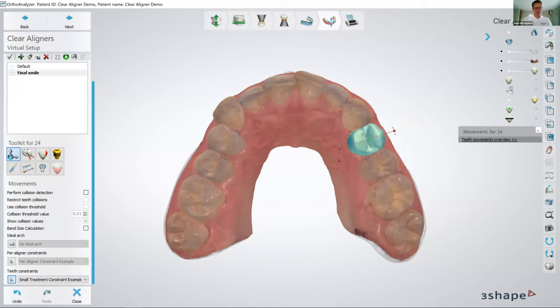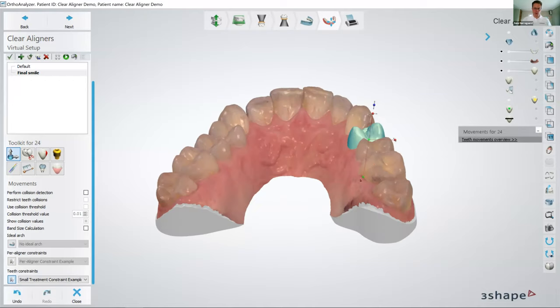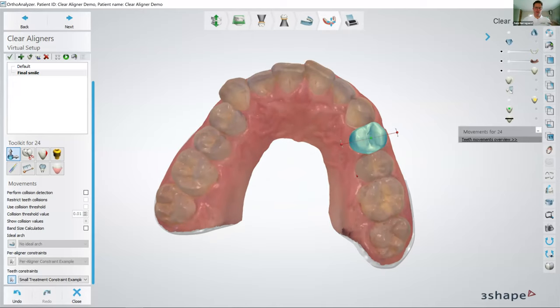You can turn off the active limitations, then you will get the visual warning. Now you are exceeding the limit. But you can continue from there. That's also an option that you have with the software. If you rotate the model in a different view, then you will get different control points. So now I can move the teeth in and out and up and down. So depending on the view, you get different control points if you use the mouse.